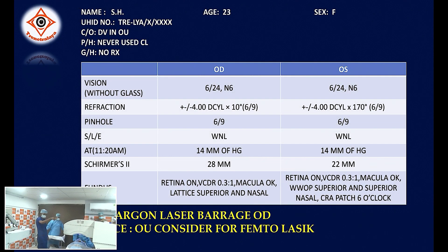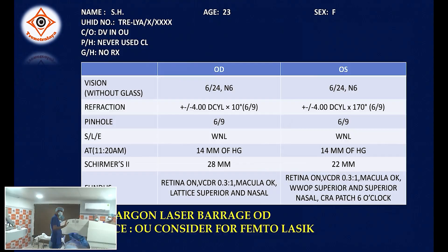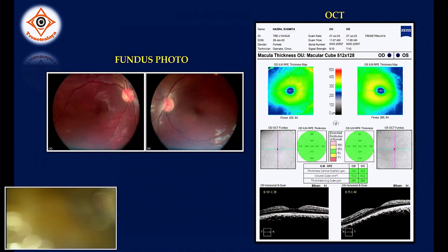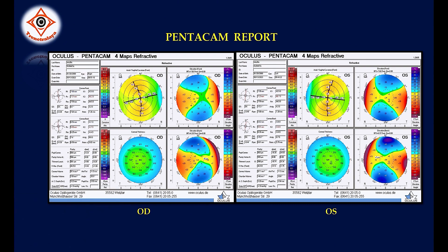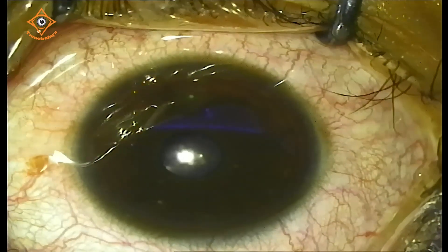Good afternoon everybody. This is Dr. Sagar. We are starting treatment of this young lady who has about minus four cylinder at 180 degrees. We are going with femto-LASIK. We are creating a 100 micron flap and the flap diameter is around 8.1 millimeters. She has about minus four with-the-rule astigmatism in both eyes.